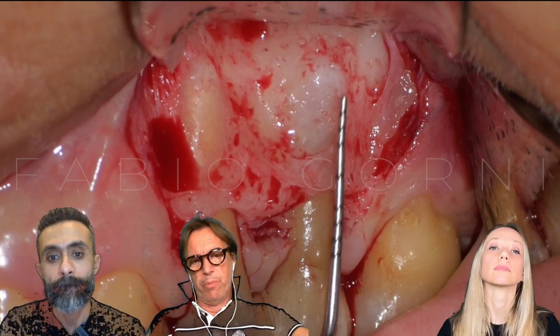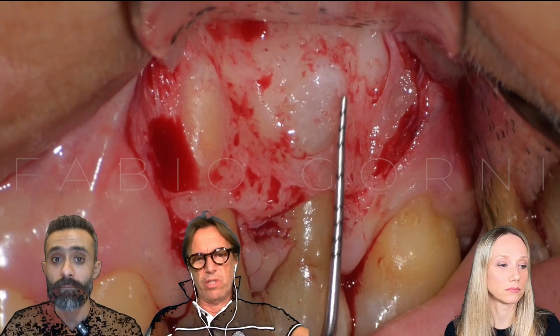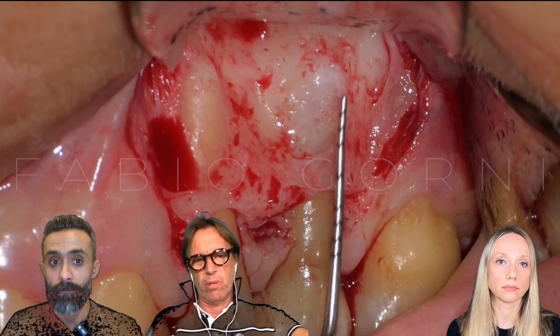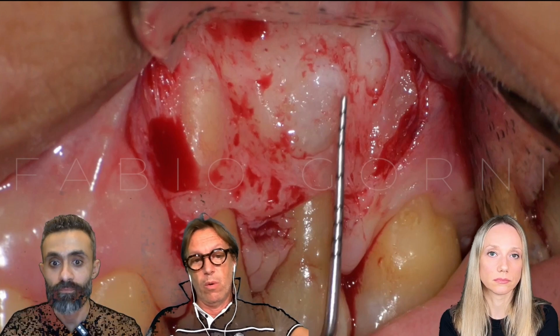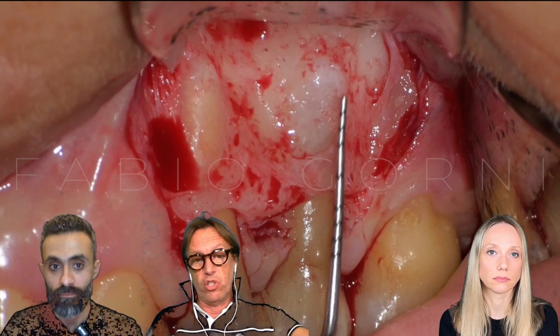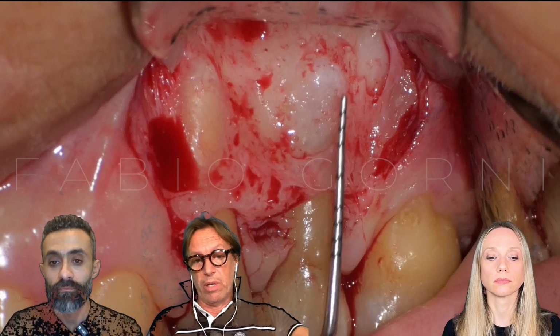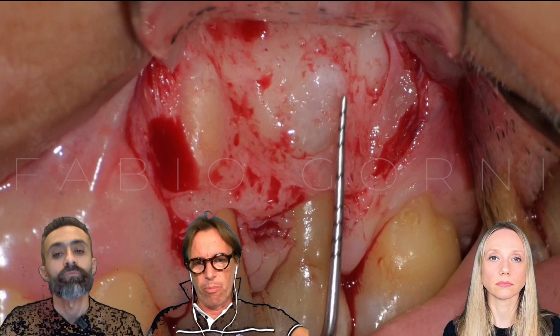In my opinion, it is a false problem. If you're able to do the surgery, it's not so difficult to identify the position of the mental foramen, that usually is between the premolars. We have to check, of course, the position mesial to distal and coronal to apical. Sometimes the mental foramen is so apical that it is never a problem.